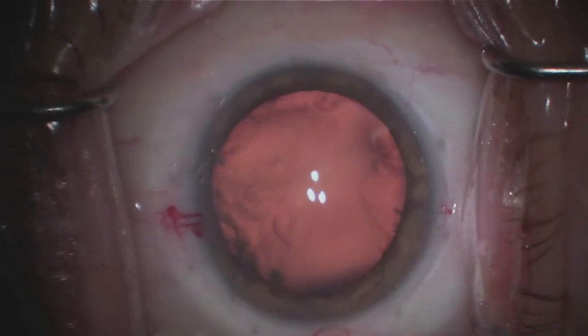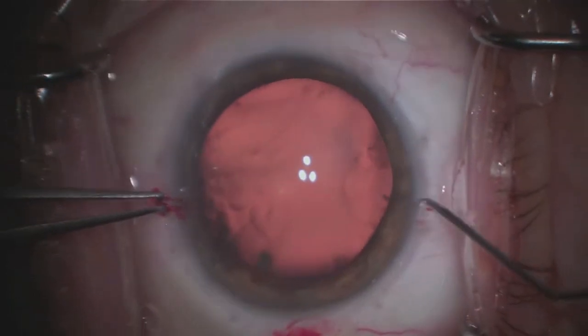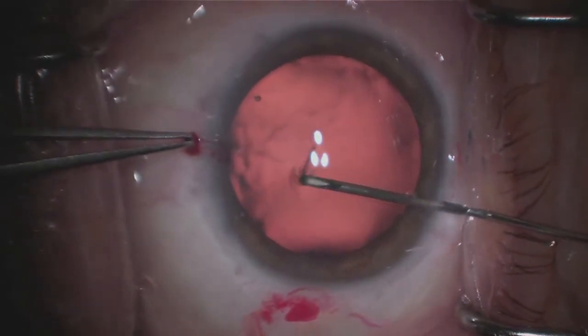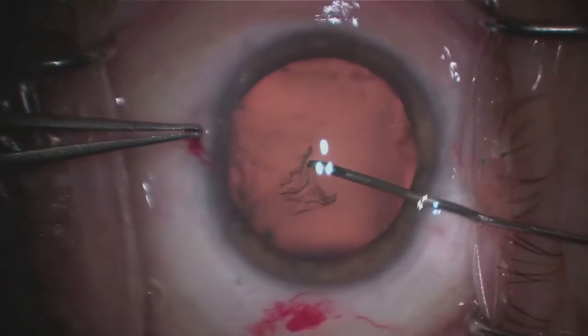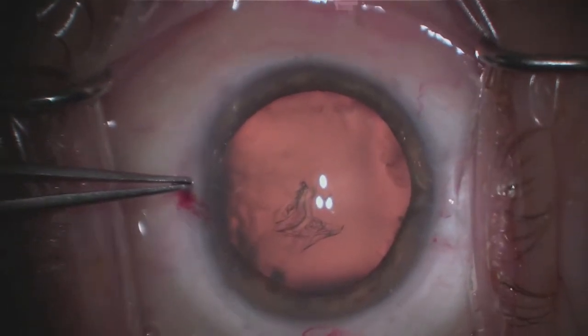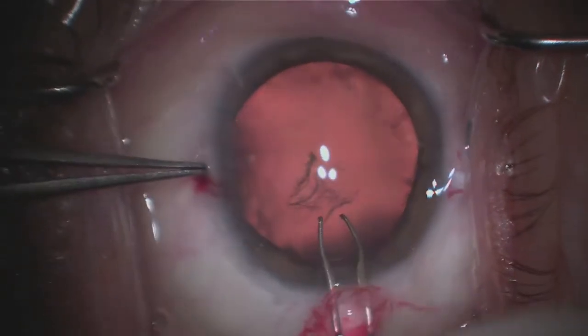Once that's done, the next step involves creating an opening in the front surface of the cataract, known as a capsulotomy. Here I'm actually creating just a small opening in what's called the capsule. Your cataract is actually encased in a transparent bag that we call the capsular bag.